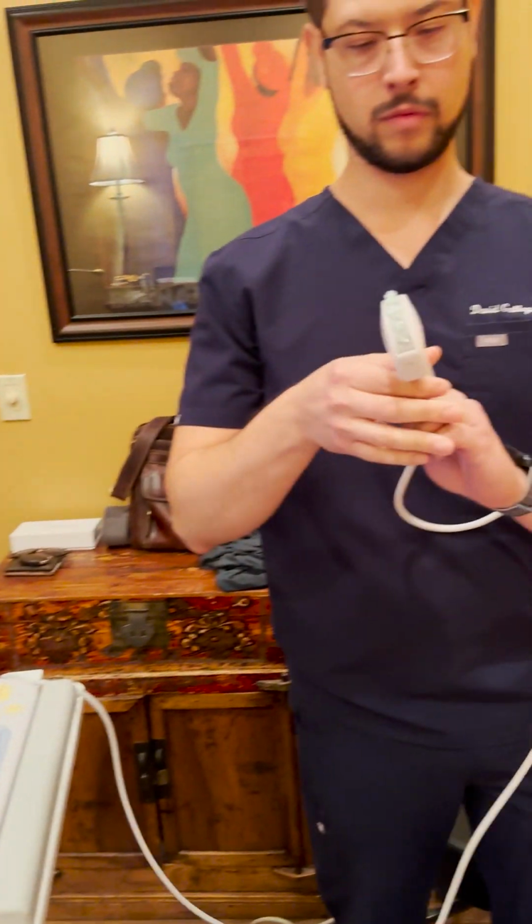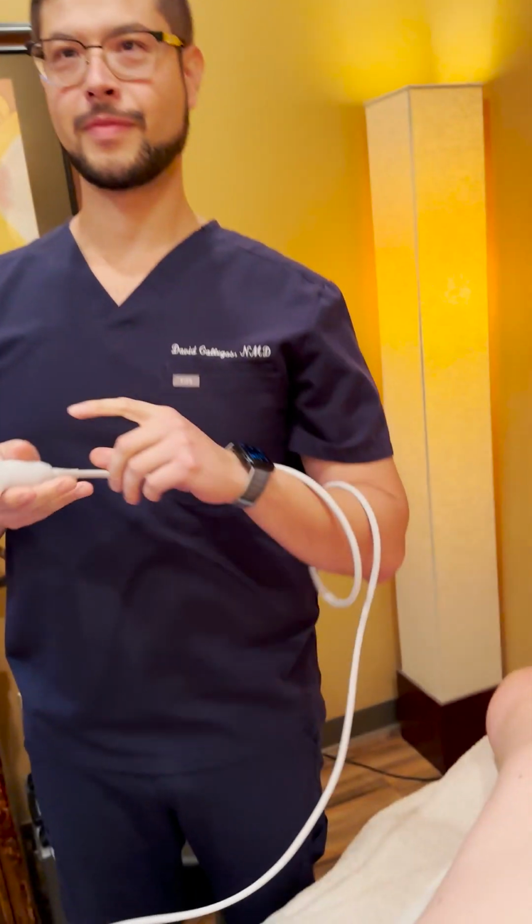Okay, we're here with Dr. Gallegos, our pain management specialist, and he's going to show us how he picks up injuries with his ultrasound. And we're going to do it on a back, someone who had an injury. And I'll go back and forth and show what you're seeing on the screen too.